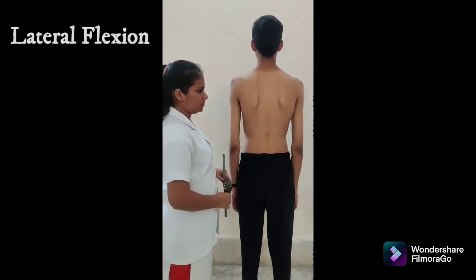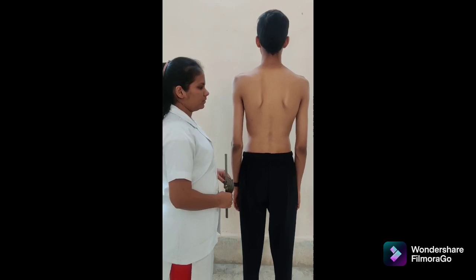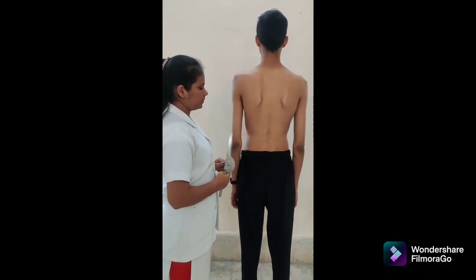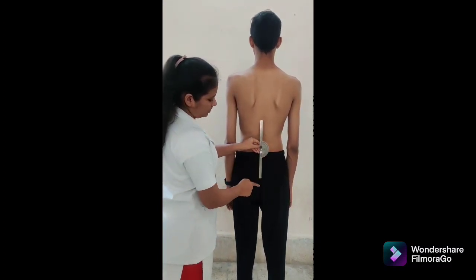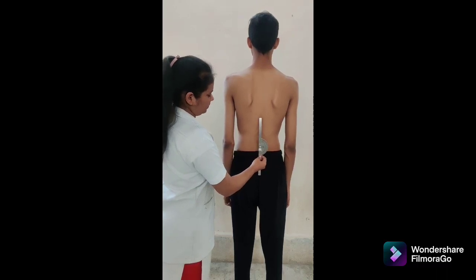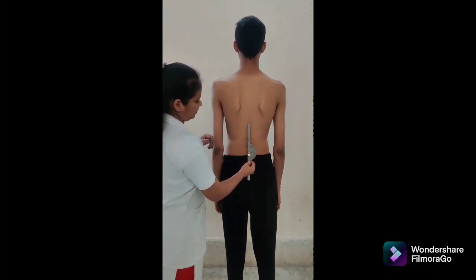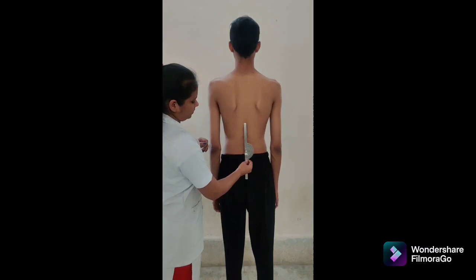There are four methods to measure thoracolumbar lateral flexion. First is universal goniometer. Patient position: standing with feet flat on the floor and knees extended. Goniometer alignment: fulcrum over the posterior aspect of the spinous process of S2, stable arm perpendicular to the ground, movable arm aligned to the posterior aspect of the spinous process of C7. As the patient bends, the movable arm moves with the movement. Normal range: 0 to 35 degrees to each side. Instruction: bend the trunk to one side while keeping the arms relaxed at the sides.